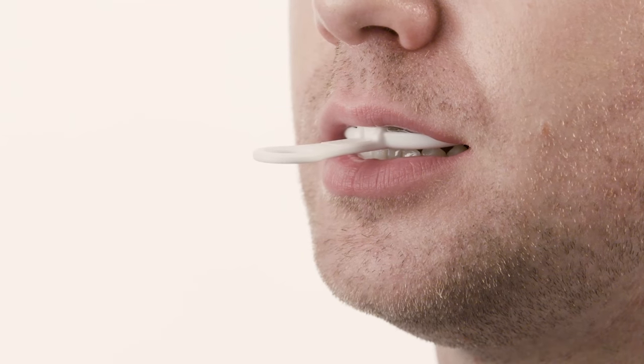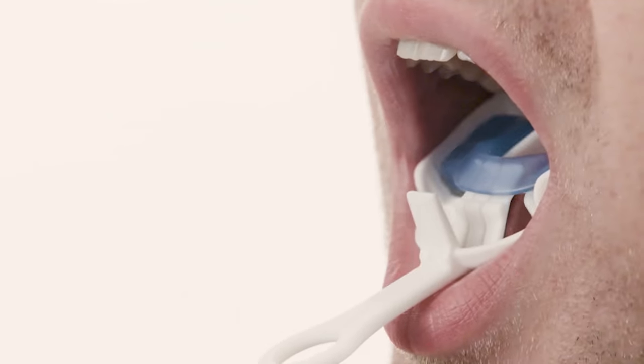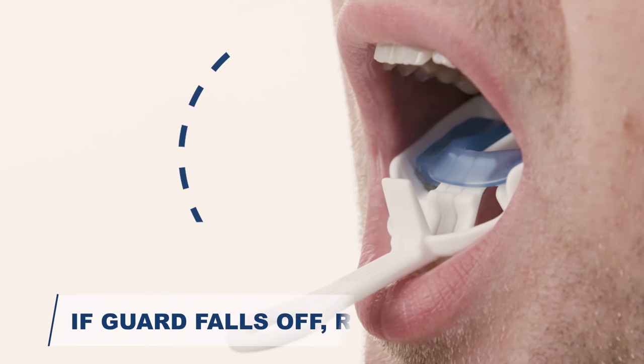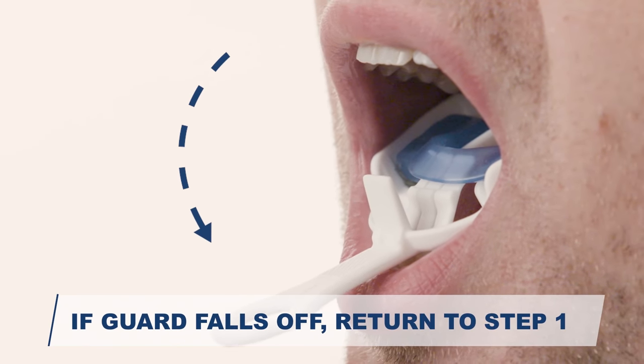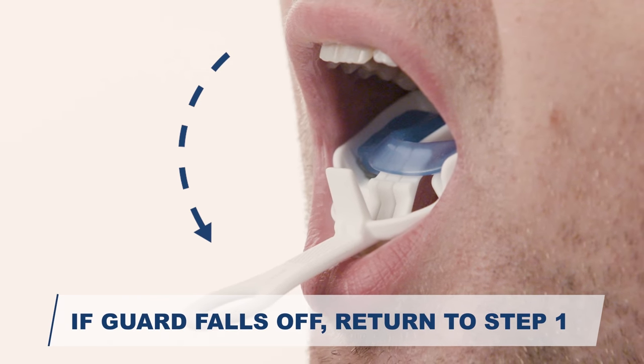Slowly open your mouth. If fitted properly, the tray and guard will remain securely attached to your upper teeth. If not fitted properly, the tray and guard will fall off of the upper teeth. If this happens, leave the guard in the tray and return to step 1.